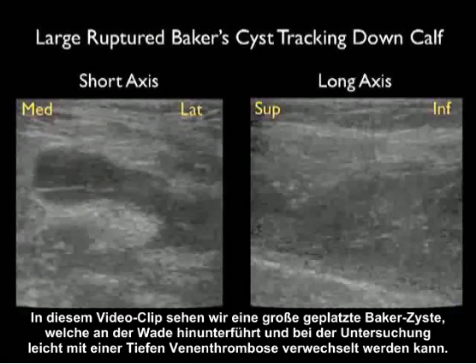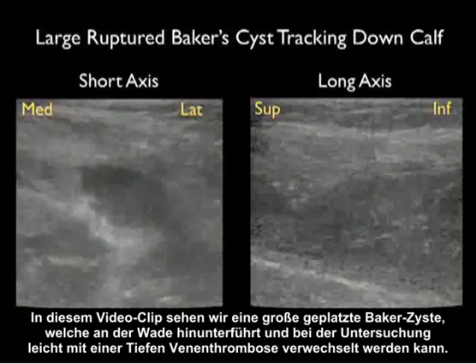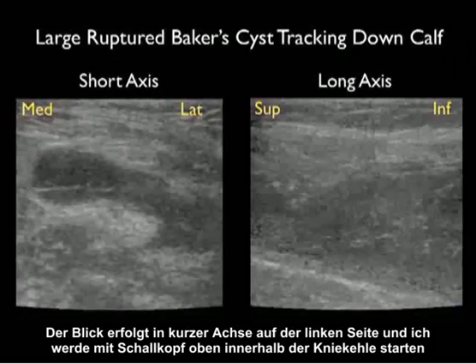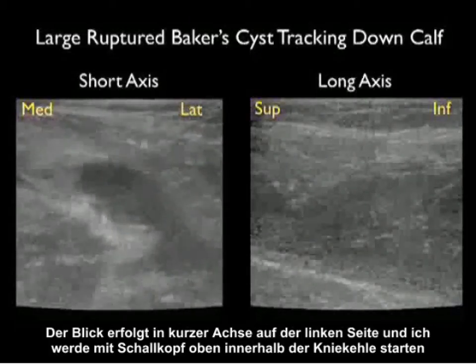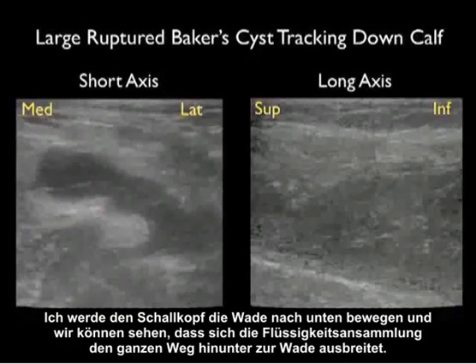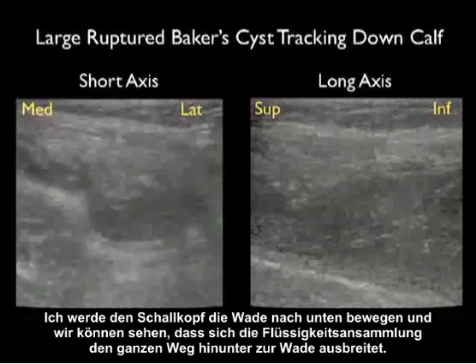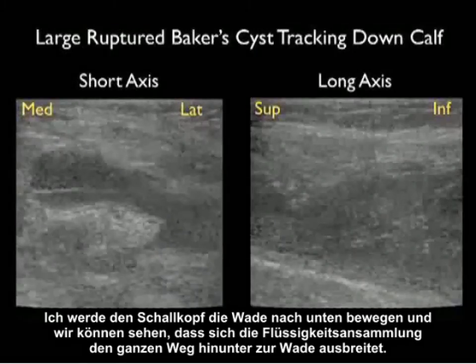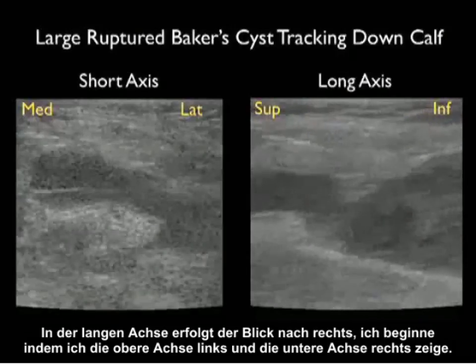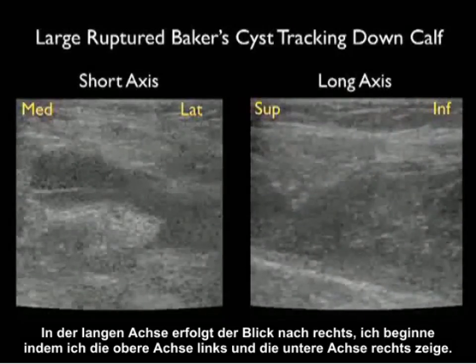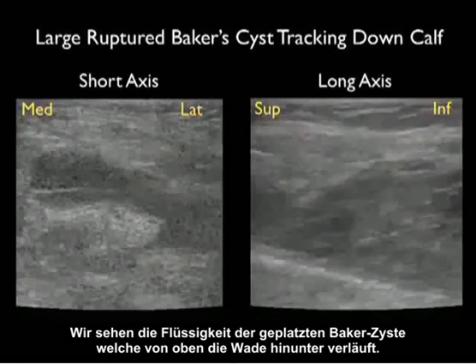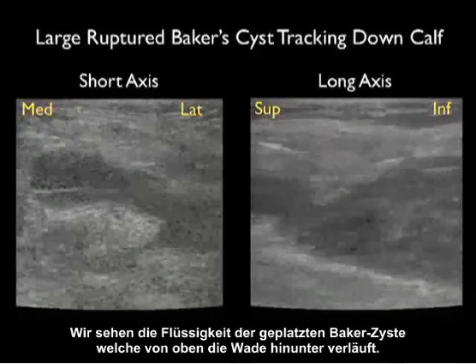In this video clip, we see a large ruptured Baker's cyst tracking down the calf and closely approximating a DVT on clinical examination. We see a short axis view to the left, starting with the probe high within the popliteal fossa, and moving the probe down the calf we can see that the fluid collection spreads all the way down the calf. In the long axis view to the right, showing superior to the left and inferior to the right, we can see the fluid collection of the ruptured Baker's cyst tracking from superior all the way inferiorly down the calf.